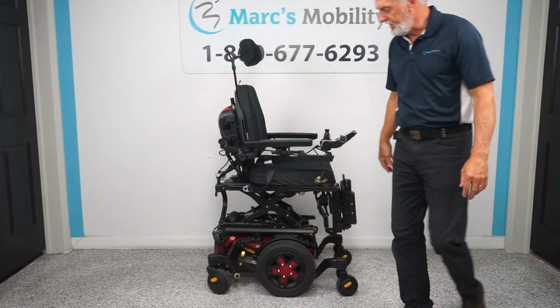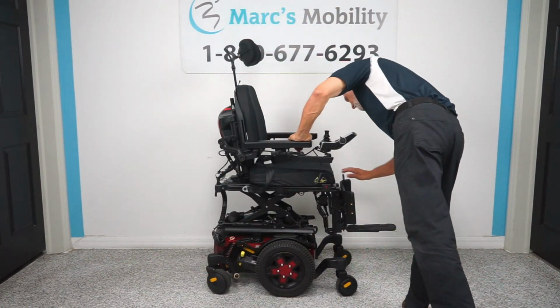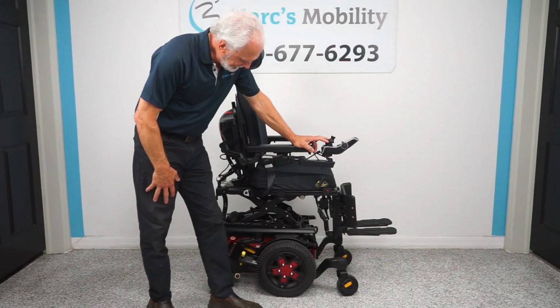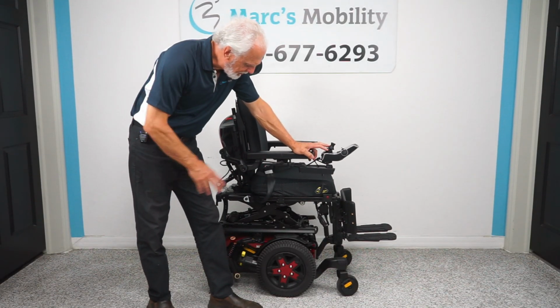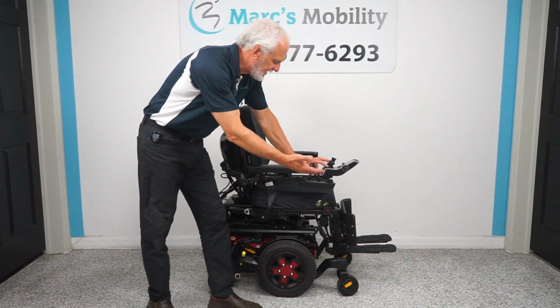Okay, I could have left the seat higher or lower. It all depends on you, how high you want to leave the seat when you get out of the chair. Okay, we're going to bring the seat all the way back down. So we've covered the base and we've covered the 12-inch seat lift. The next thing we're going to do is called the electric tilt.